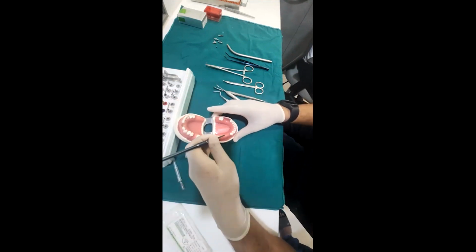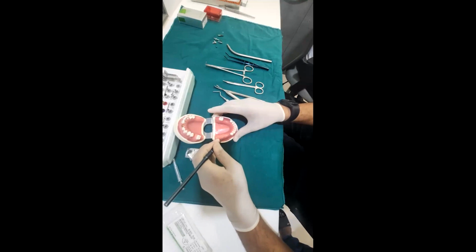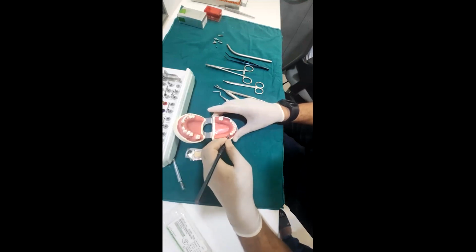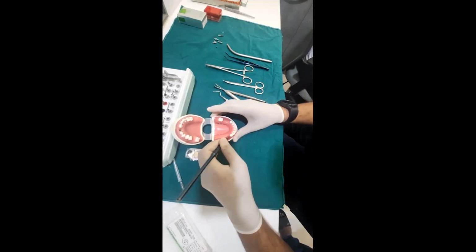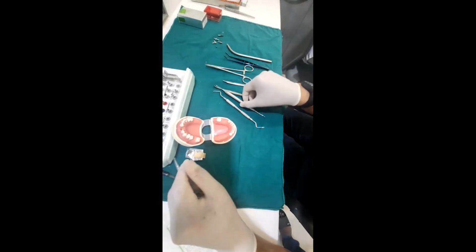And try and have a nice clean straight cut, a small releasing vertical, and a little bit of cervical along the adjacent tooth to separate the thin mucosa.